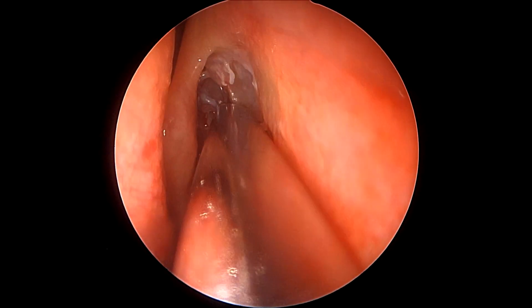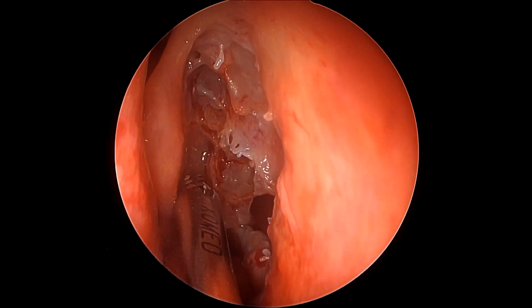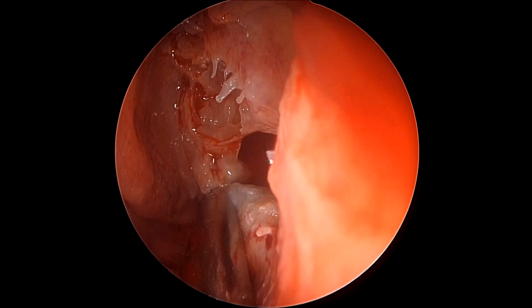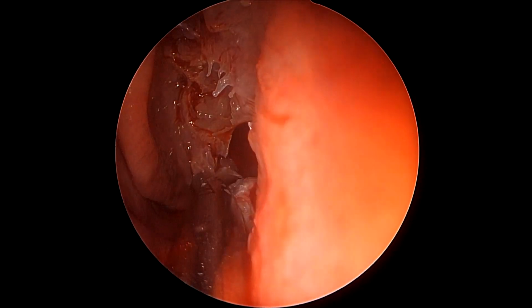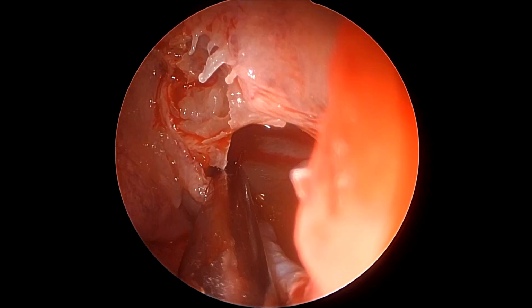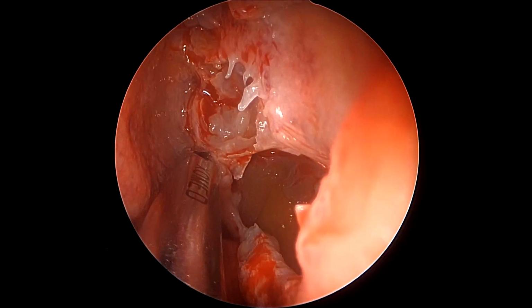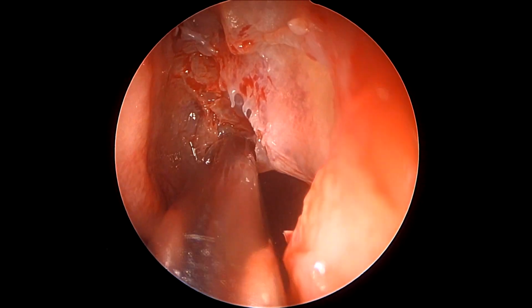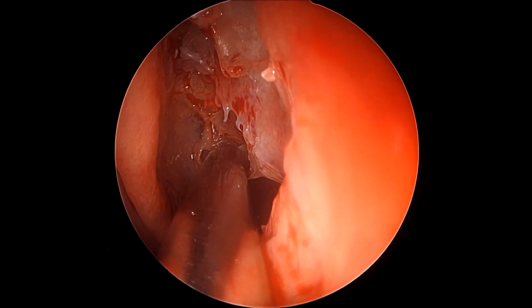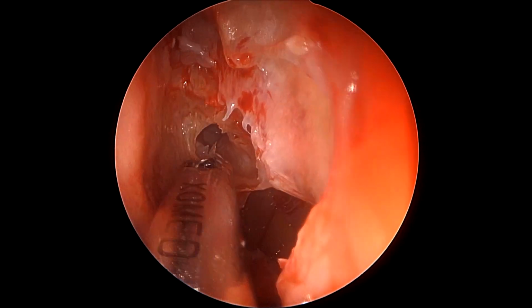So this is complete clearance of the uncinate process and exposure of the agger nasi cell on the left side, and also creating a reasonably wide antrostomy, again to be used as not just an opening of the antrum but also as a surgical landmark to help us guide our way and navigate throughout the posterior ethmoidal complex and the sphenoid sinus. This might become very valuable, particularly in instances of revision surgery and scarring. We will not have the middle turbinate to guide us.